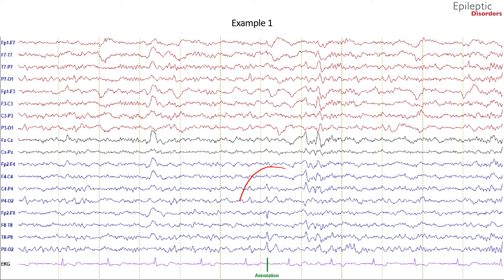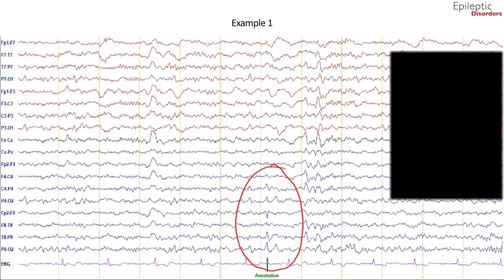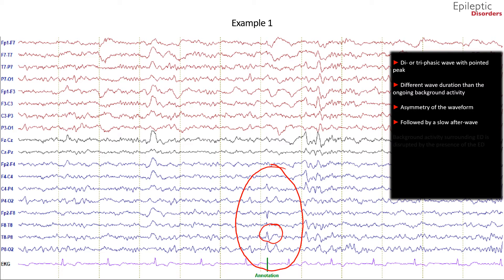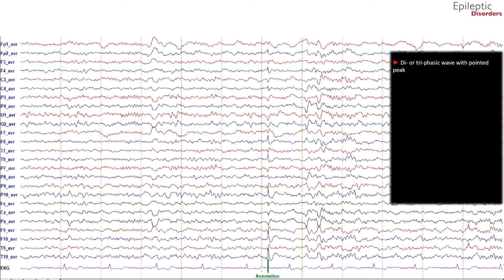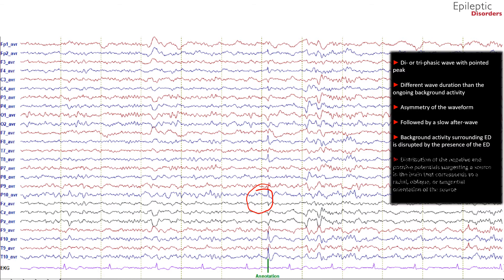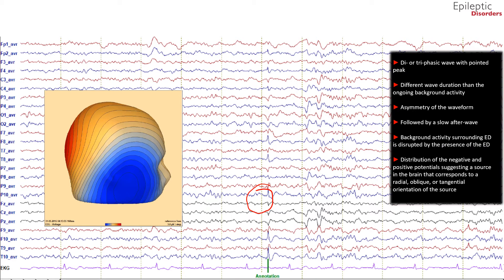In this example, we will take a look at the sharp wave located in the red circle. Initially, on first glance, you can see there is a diphasic wave with a pointed peak. Additionally, the waveform in question has a different wave duration than the ongoing background activity. There is asymmetry of the waveform with a steeper downslope in comparison to the upslope. There is a slow afterwave, as best noted in the T8 and P8 region. Looking at the same waveform in average montage, you can see clearly the respected field of the waveform. Concerning criteria number 5, you can see before the spike there is an increase in beta activity. Looking at the voltage maps, you can see the source of the waveform is clearly from the brain, thus confirming an interictal epileptiform discharge in the right temporal region.